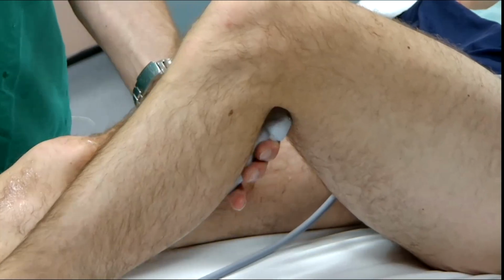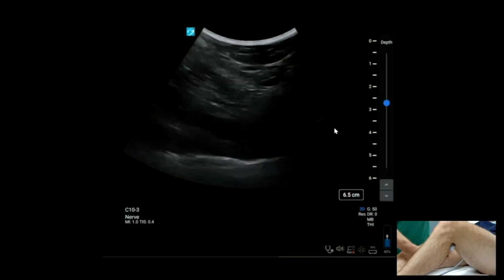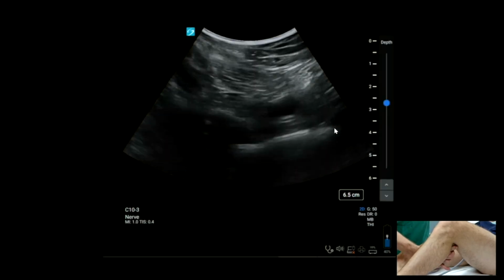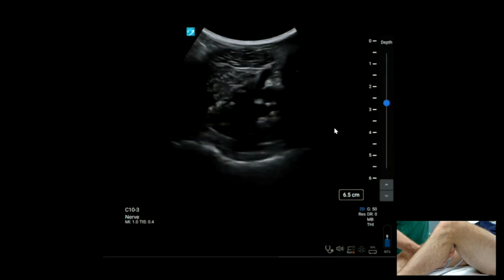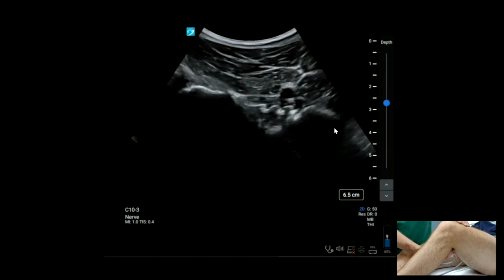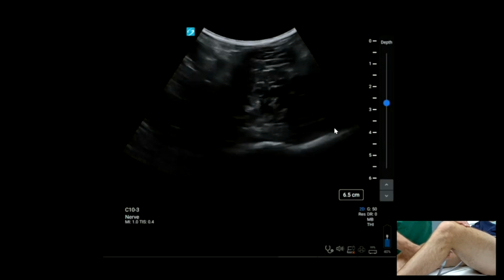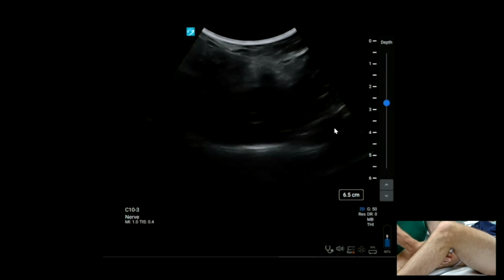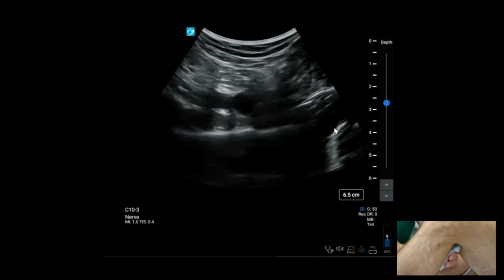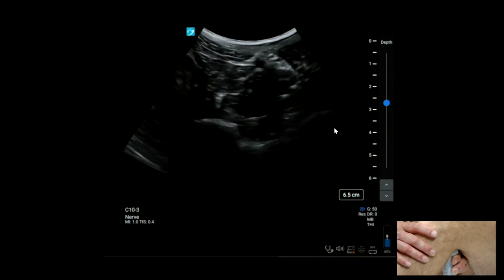So I'm in behind the knee like that. Okay. So I need to actually put this on to scan. I don't think it's going to show so well because I'm rocking my probe distally to look at the condyles of the knee. There's the condyles of the knee, and coming back, the femur is flattening off at this point. Sorry, Max, you're moving. Everything's moving here. So rocking forward into the condyles of the knee and back.